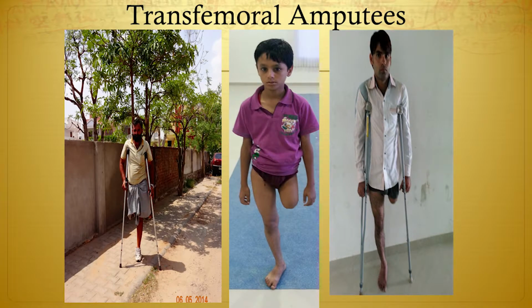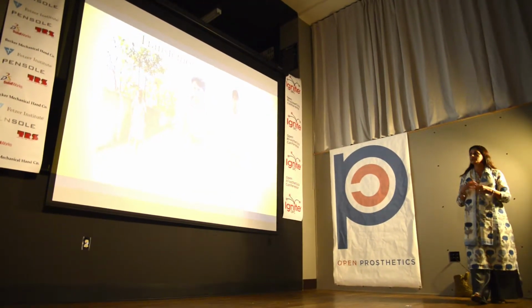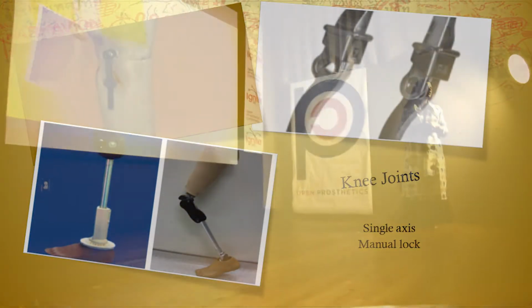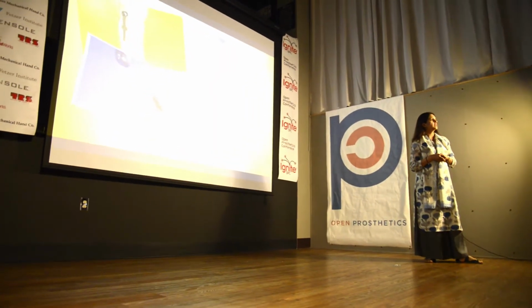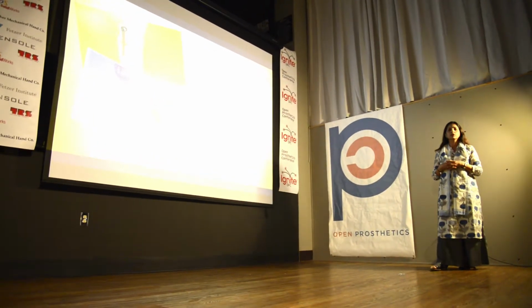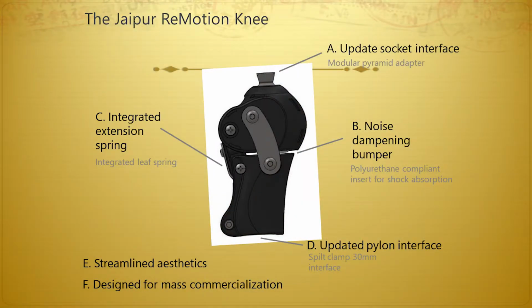So for the transtibial amputees, we nearly have our act together, but for transfemoral, which form 30% of our amputees, the only options that we had are single axis knee joints with a lock. Now single axis knee joints have their limitations and they result in an ergonomically inefficient and cosmetically awkward gait. But because of non-availability of any other better options, that's what's used traditionally in all developing countries. So we started working with Stanford University and DREV, a not-for-profit organization, and designed a polycentric knee joint.